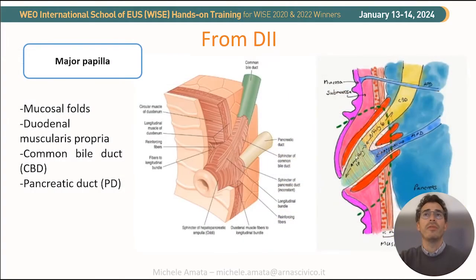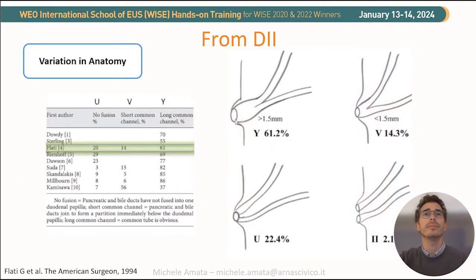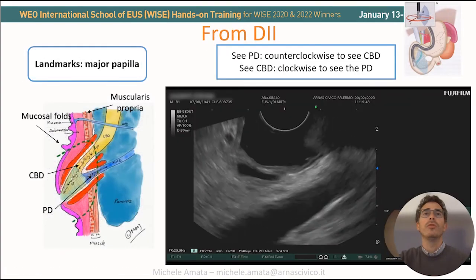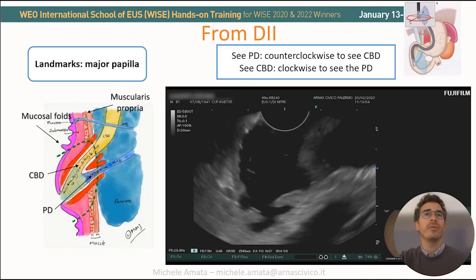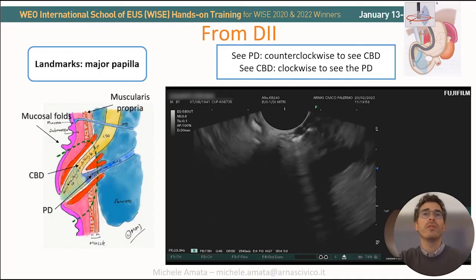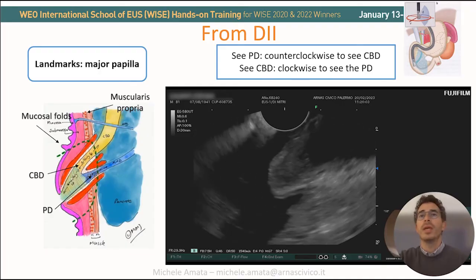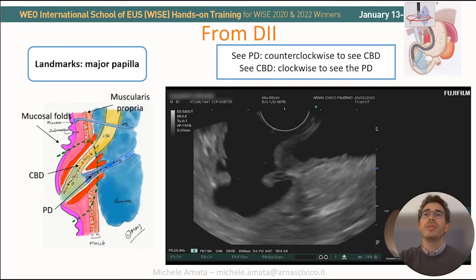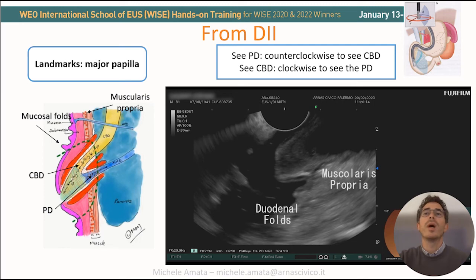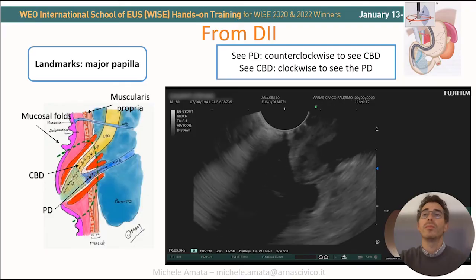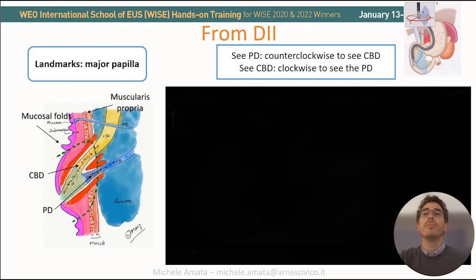From the second portion of the duodenum, we can study the major papilla in very detailed fashion, looking for landmarks: the mucosal folds, the duodenal muscularis propria, the CBD, and the MPD. To better evaluate the papilla, we use the balloon and inject saline solution inside the lumen to distend the duodenal folds and aspirate the remaining air. We need to use very soft clockwise and counterclockwise movements. In this case, we see a papillary lesion with an enlarged aspect obstructing the common bile duct and the main pancreatic duct. Moving counterclockwise, we see the CBD; returning clockwise, we are back to the MPD. This papillary lesion did not extend beyond the muscularis propria.